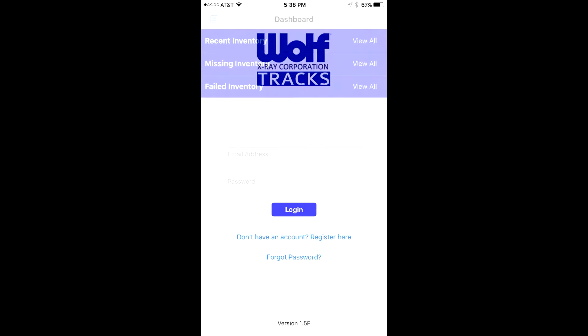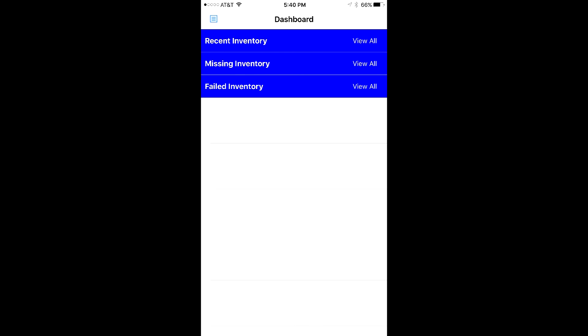Once logged in, you have a series of options to choose from, while first being brought to the QuickView dashboard that lays out the recently entered aprons, missing aprons, along with any failed inspections.